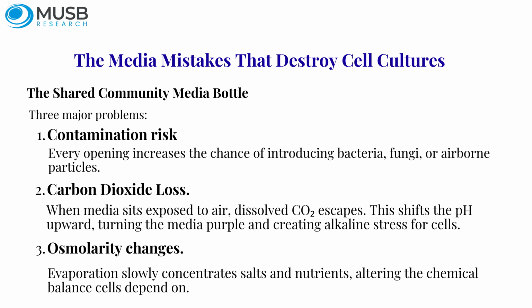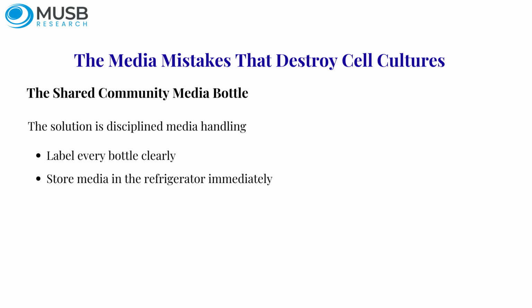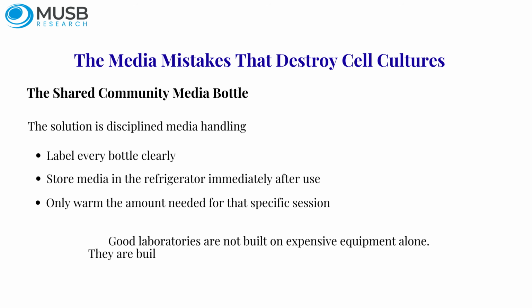Even if contamination never becomes visible, the media itself may no longer support normal cellular behavior. The solution is disciplined media handling. Label every bottle clearly. Store media in the refrigerator immediately after use. And only warm the amount needed for that specific session. Good laboratories are not built on expensive equipment alone. They are built on consistency, discipline, and respect for small details.